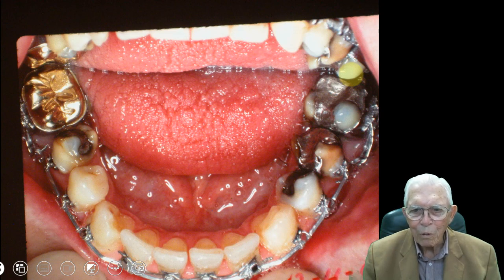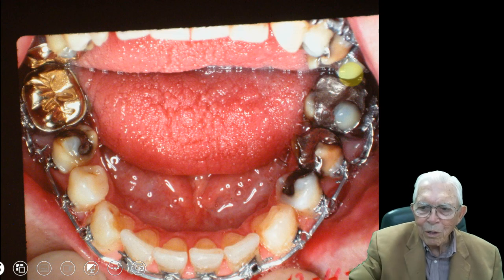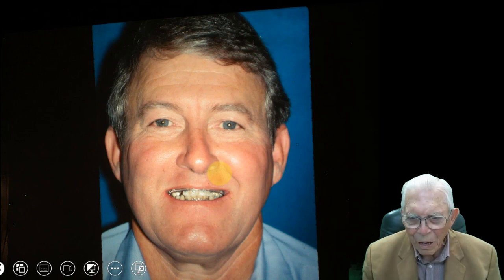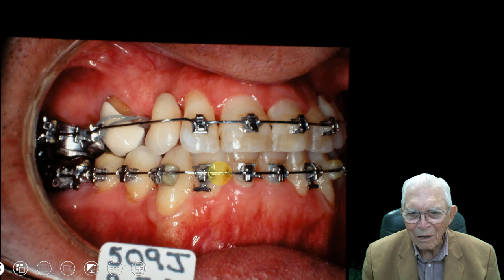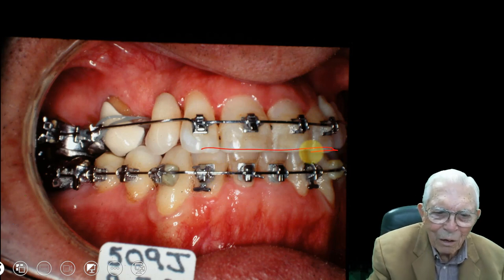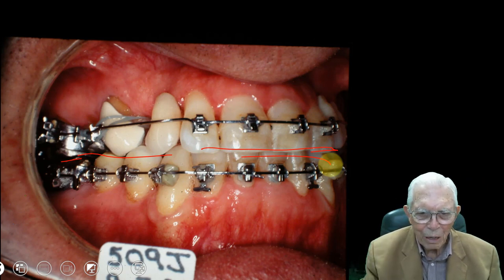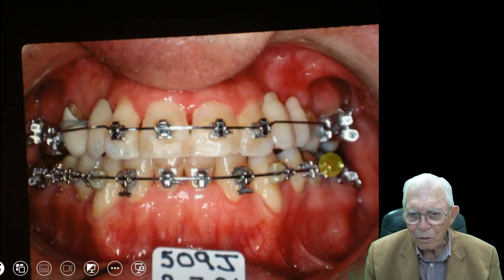Look at where this arch is right here on the bottom — this was out to start with, and the upper is going to be out over the top of it. Here he is — we've given him a little bit of height in the facial structure, and looking from that side you can see the difference. He smiled a little bit while we were working on him. He's got his teeth together where he can chew in the back part of his mouth. Now we've got the upper teeth out over the bottom teeth — they were fitting inside there, and they would tell you that you cannot do that, but you can do it.